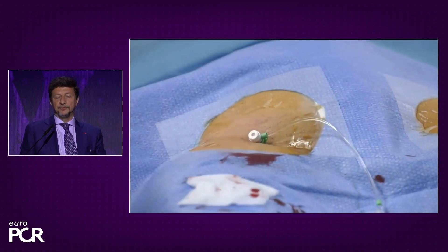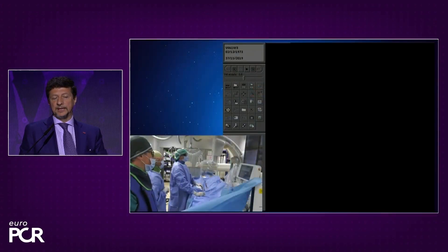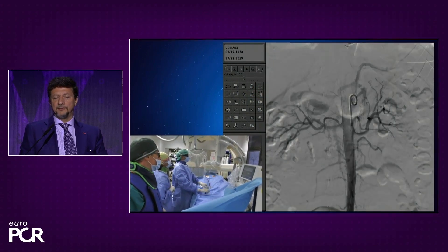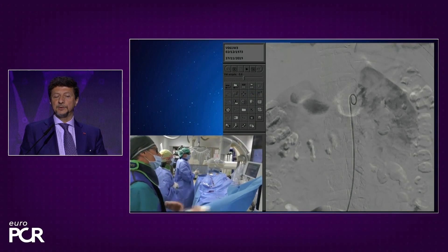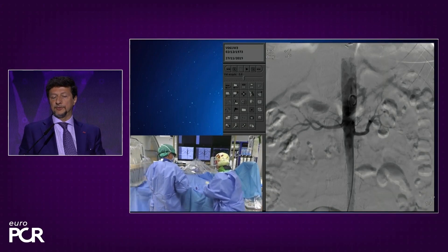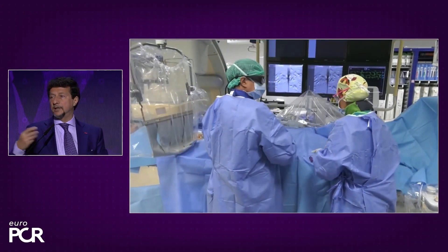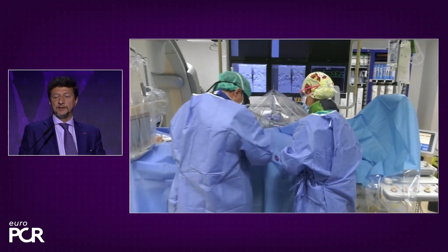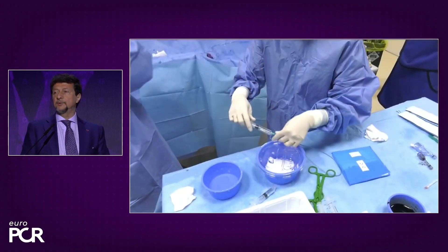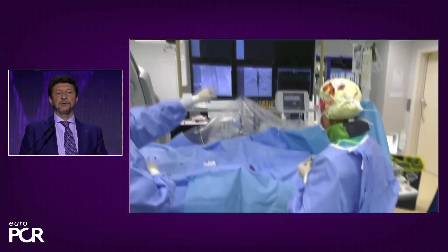We have prepared this video for you to understand how it works. This is a setting of the CAT lab — you have a six French introducer in the right femoral artery, and you should start with a non-selective angiogram of the aorta to see where the origin of the artery is. This is very useful to avoid wasting time and contrast trying to find the artery selectively. This can be done with subtraction angiography with 10cc of contrast.